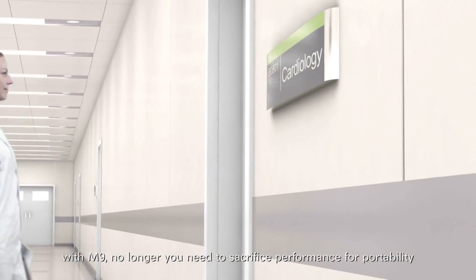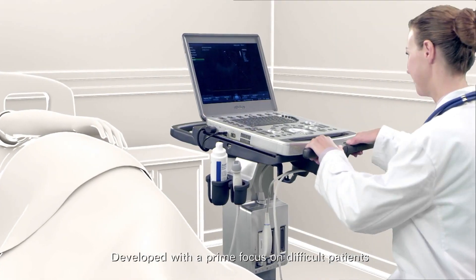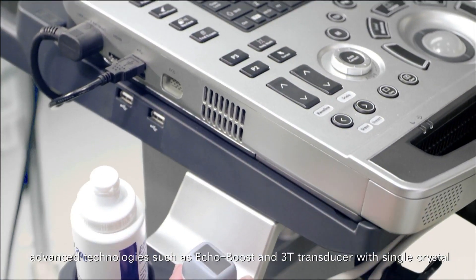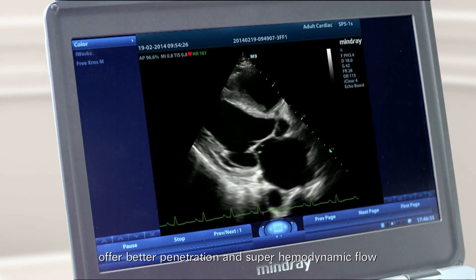With M9, no longer do you need to sacrifice performance for portability, developed with a prime focus on difficult patients. Advanced technologies such as Echo Boost and 3T transducer with single crystal offer better penetration and super hemodynamic flow.